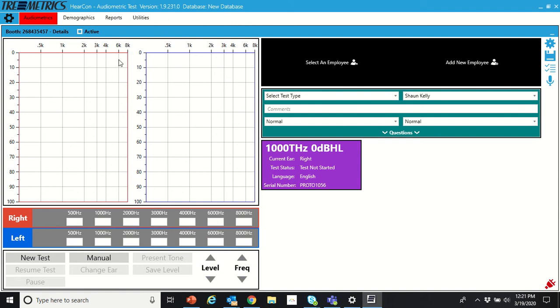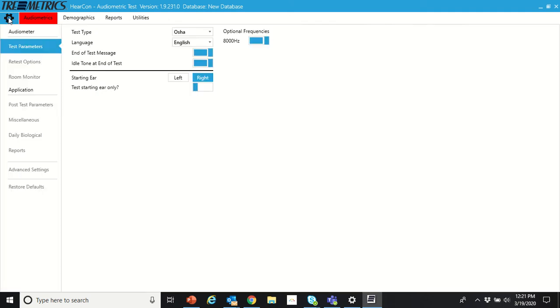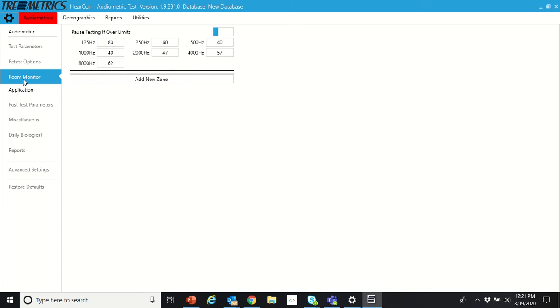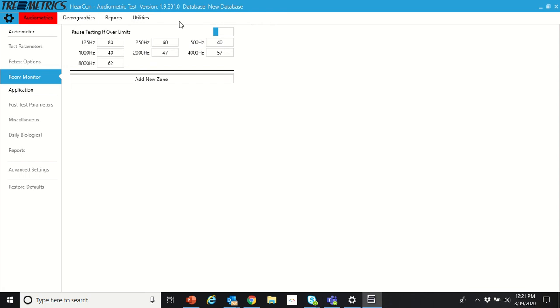If we go into the gear icon in the top left, third one down, room monitor, here are our settings for the room monitor. Pause testing if over limits - you can turn this on or off. When it's on, if it gets above whatever values you have outlined in these boxes, it's going to pause the test. When it gets below those values, it resumes the test. The operator doesn't have to do anything.